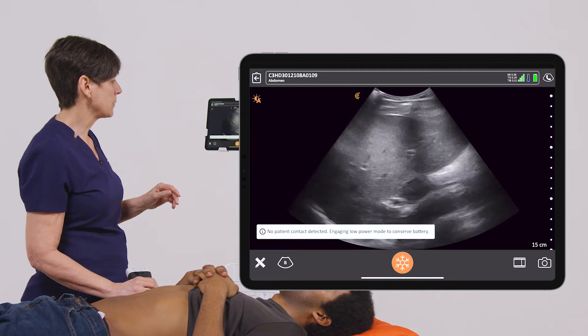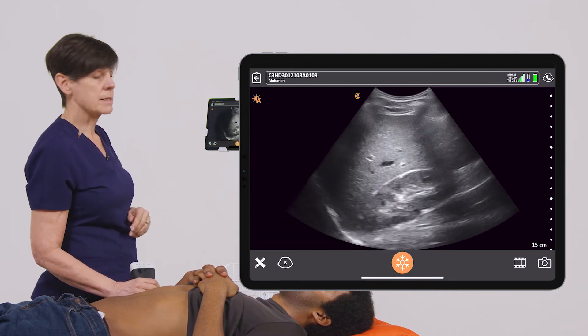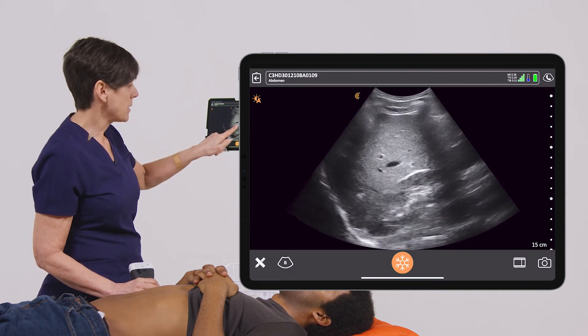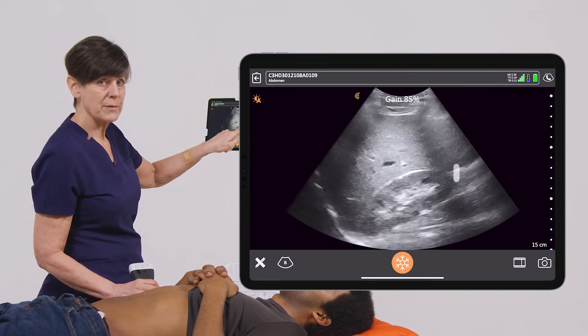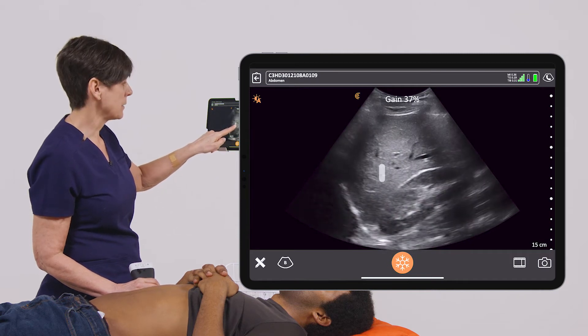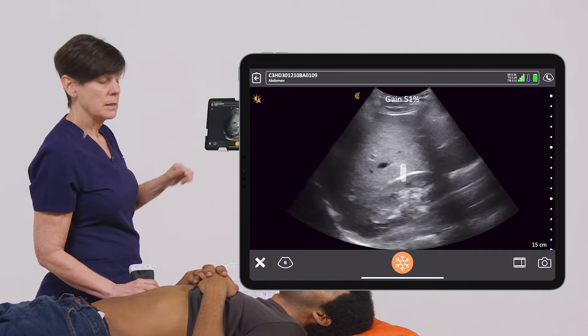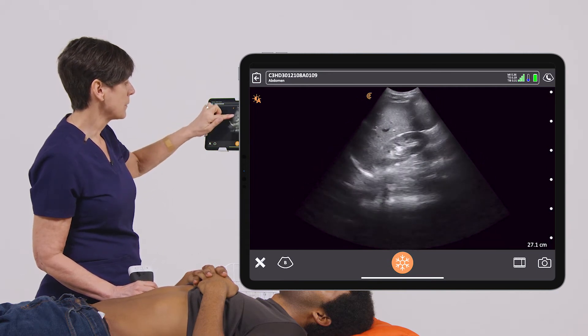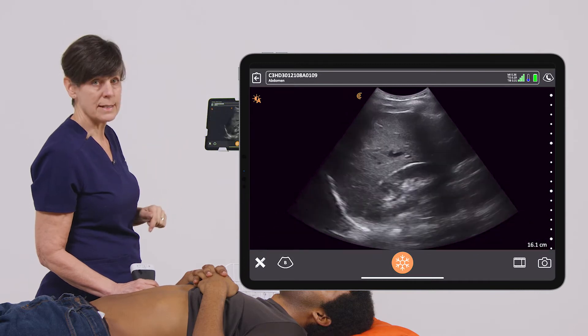So in the abdominal setting, getting a nice image of the liver and the kidney. If I want to increase my gain, I just slide my finger to the right. If I want to decrease it, slide it to the left. To adjust depth, I swipe up for more depth and down for less depth.